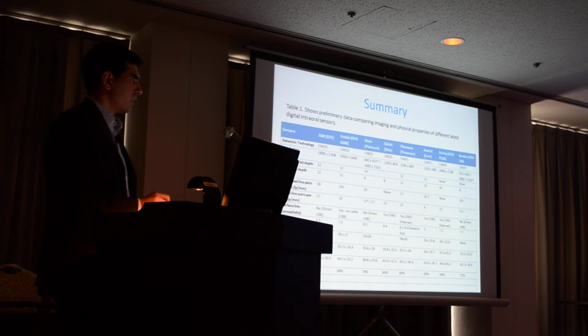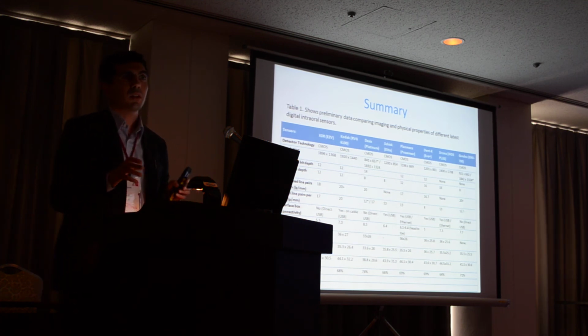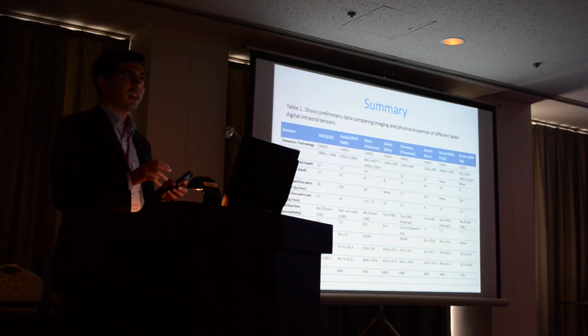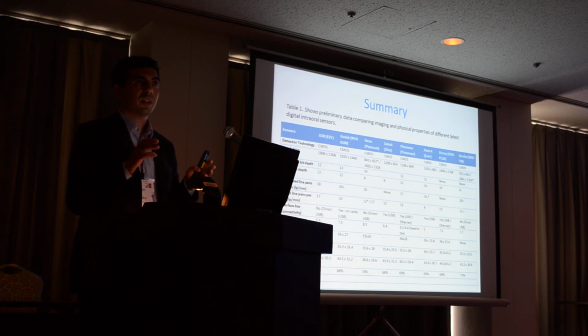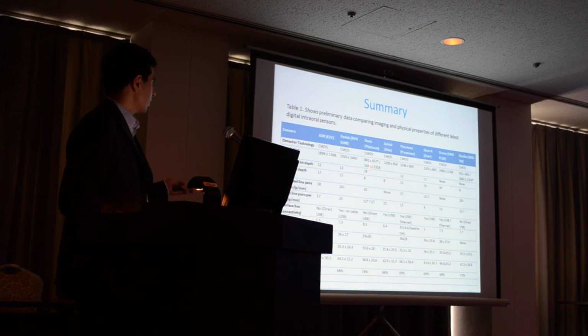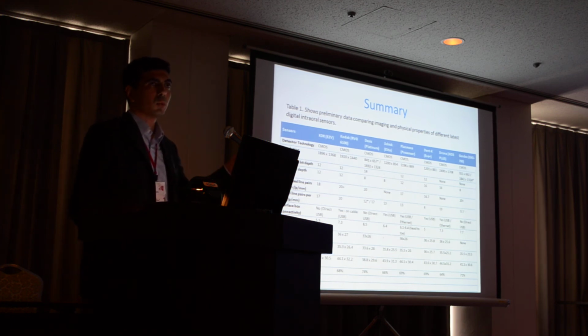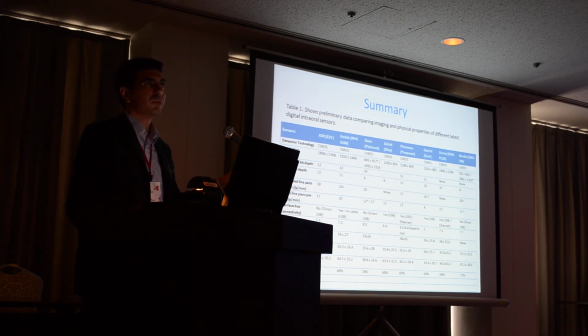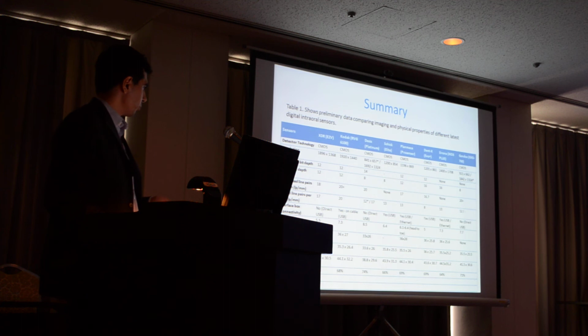The surface area represents the total surface area of the sensor, or the plastic of the sensor. If you take the active area and divide by the surface area, you get the total utilization of the surface of the sensor. Basically, you want more active area and less plastic. Most of the sensors scored around 65 to 70. DEXIS was probably the highest with 74. This was measured for a size 2 sensor. Once you go to size 1, the value becomes less, and when you go to size 0, you are basically around 55% utilization.